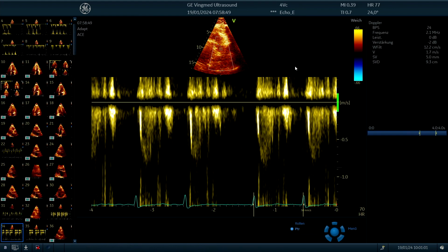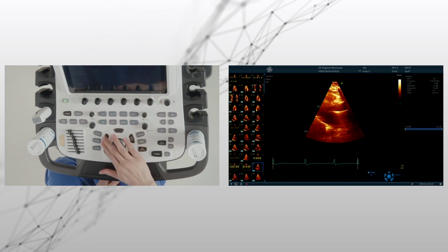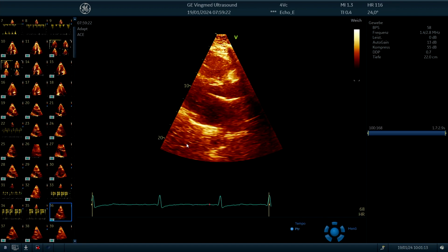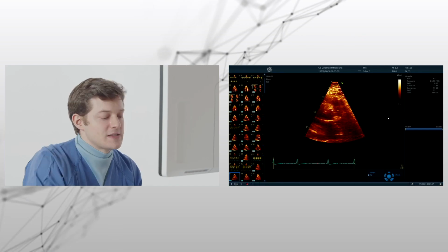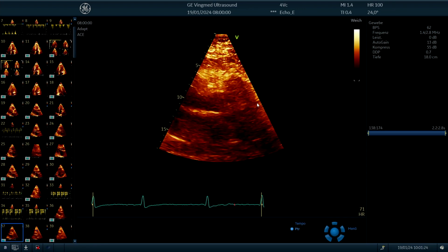We can do it again, and we can also continue with our evaluation, and here we see there is no pericardial effusion. This is the descending aorta, this is lung tissue, this is the pericardium. There is no free fluid, so it's not entirely black. In the short axis we do see the aortic valve over here. It's probably there's no relevant pathology, but it's very hard to see.